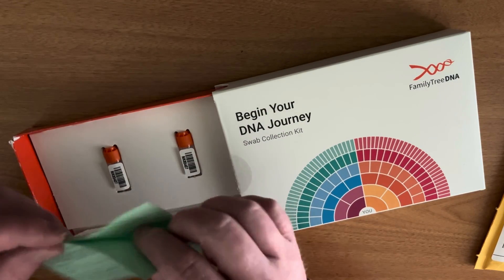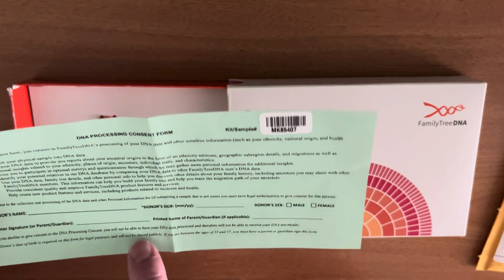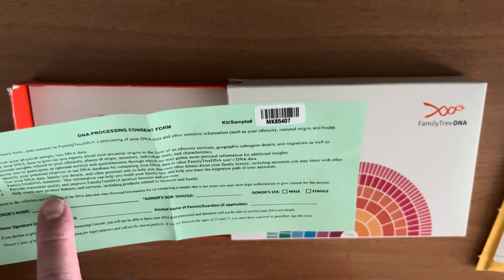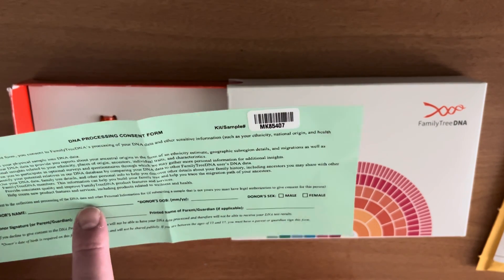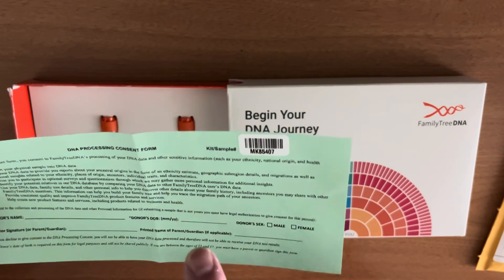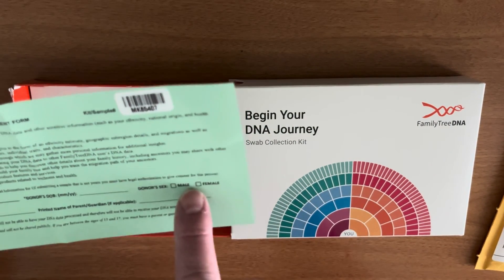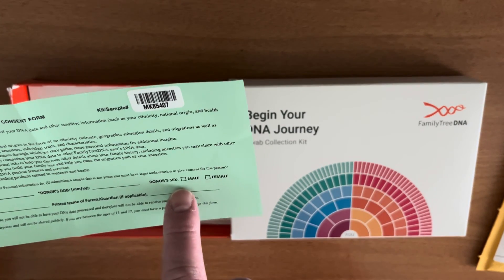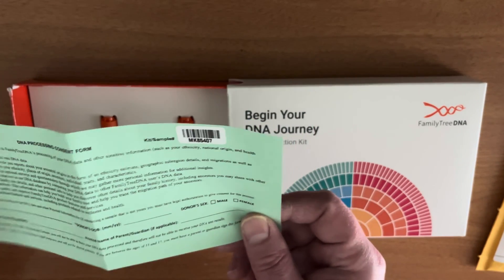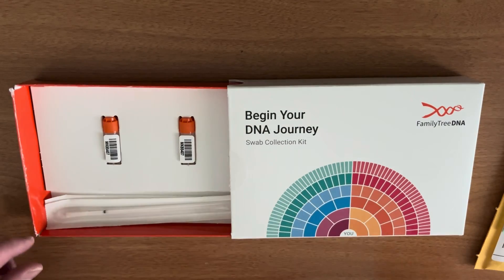Here's that green consent form, which you'll need to read and sign. You consent to converting your physical sample to DNA data and some other things. You consent to the collection and processing of DNA. Check out my video on the Family Tree DNA Terms of Service and Privacy Policy before you complete this. Your name, your date of birth, sex — male or female, meaning do you have a Y chromosome or not — and your signature and your printed name. That also has to go back with your kit. Double check and make sure the serial number is the same as all the other materials you've been given.